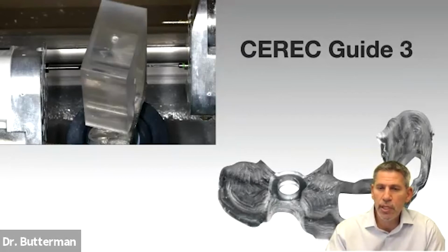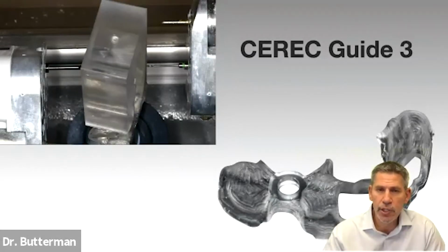So the guide itself is manufactured, but what we want to do is keyless surgery. So when I'm using a CEREC Guide 3, I'm generally going to be doing an Astra EV implant with it because that's compatible with that.